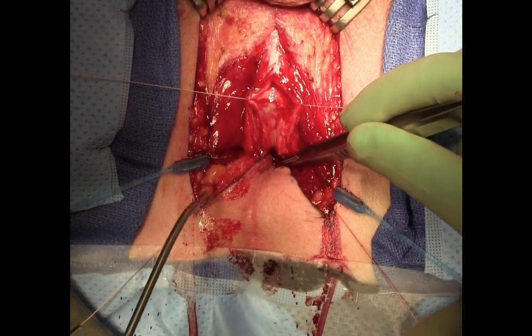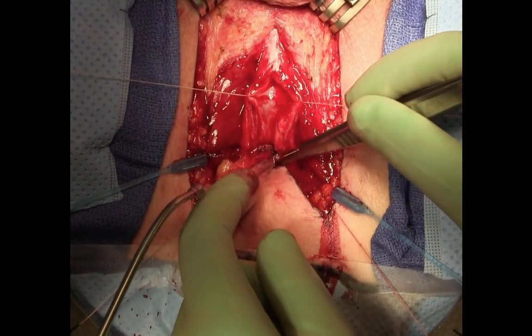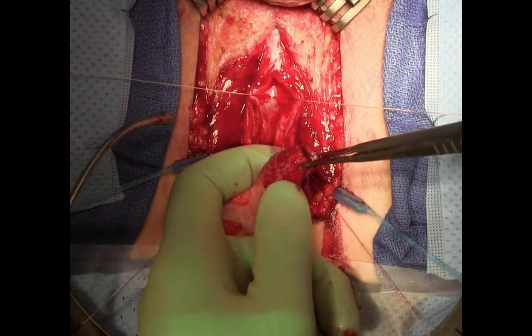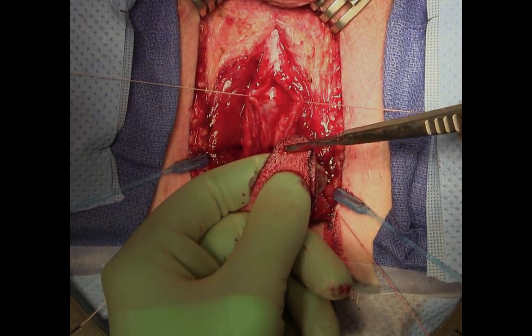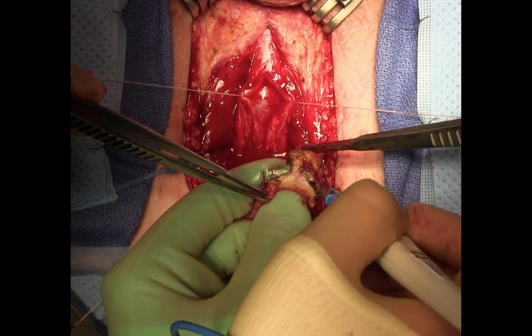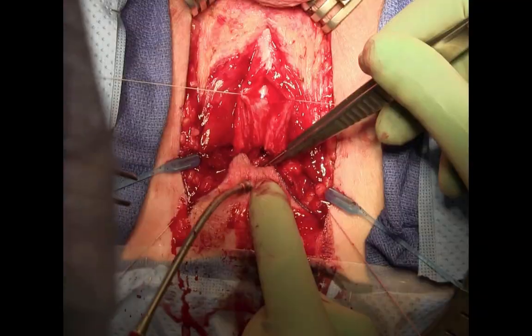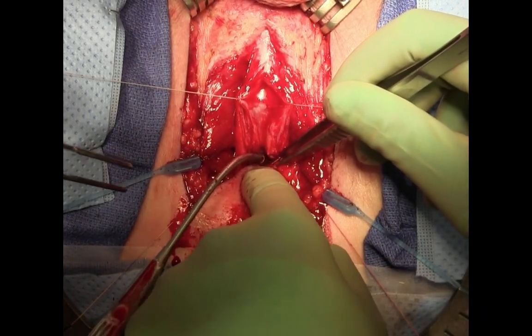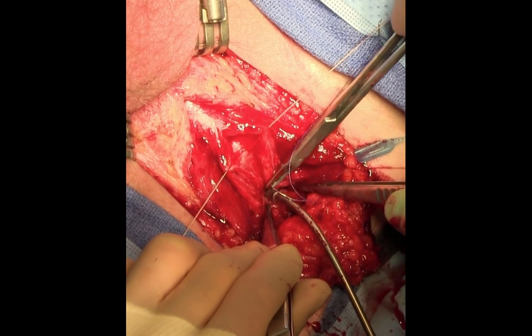Here the advancement flap is measured, and there's some extra humping of the skin, which is not ideal. So the advancement flap is trimmed somewhat so there'll be a tension-free anastomosis, but not extra skin associated with the flap. Now the advancement flap fits without tension down to the proximal urethrotomy.